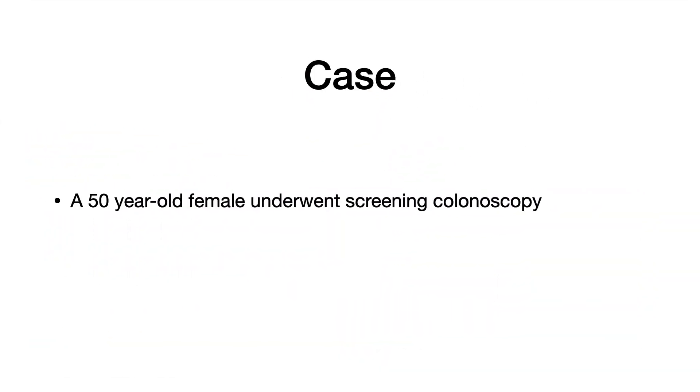Long time no see everyone. Today I'm going to update about my practice for the colonoscopy insertion technique. I will show you a case of a 50-year-old female who underwent screening colonoscopy.